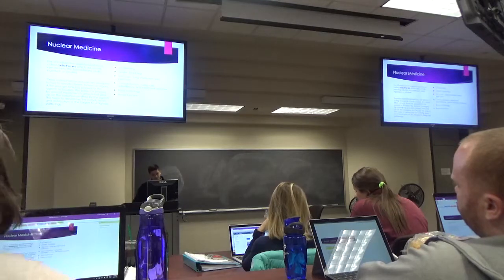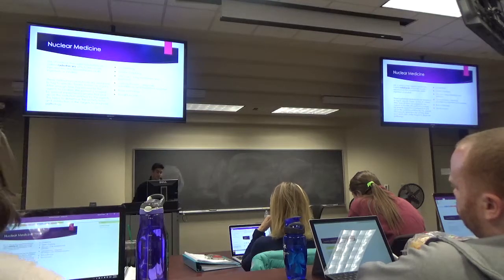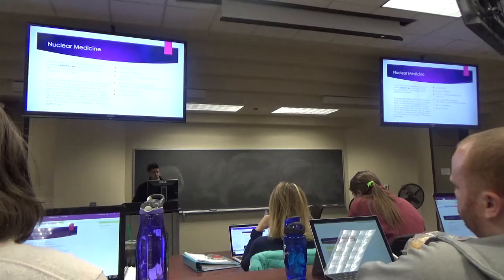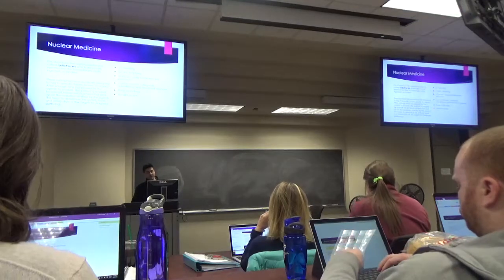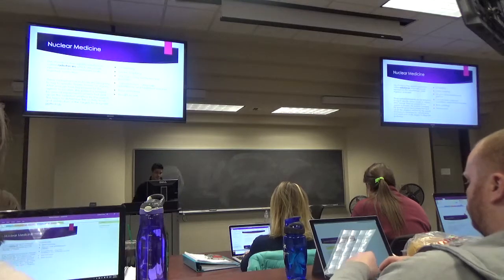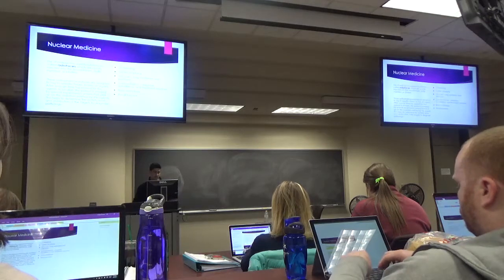But commonly we use these studies to look for any GI bleeding, and for gastric emptying studies. So this is for the gastroparesis patients, your diabetics. We do VQ scans, which you'll get a lot. These are lung ventilation and perfusion scans. These are for people who cannot get a CT PE protocol. So if you're worried about pulmonary embolism, you can get a VQ scan to evaluate for embolism if the patient cannot get contrast, which you'll encounter from time to time as well.